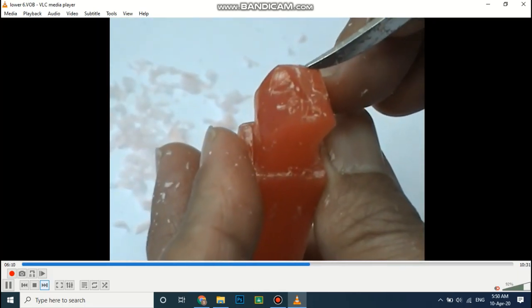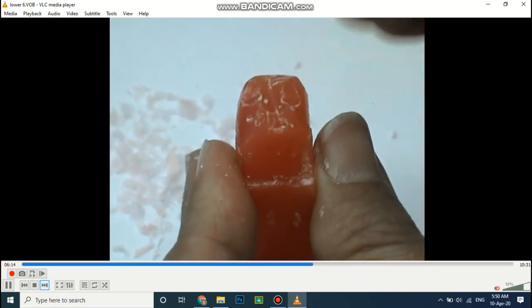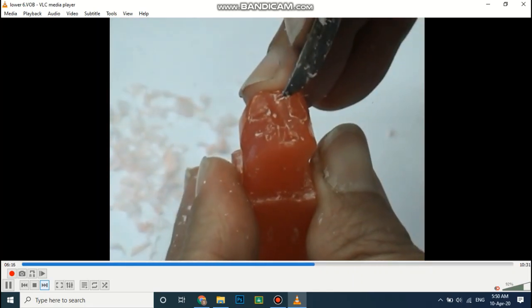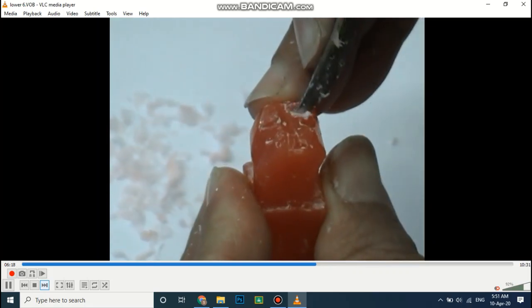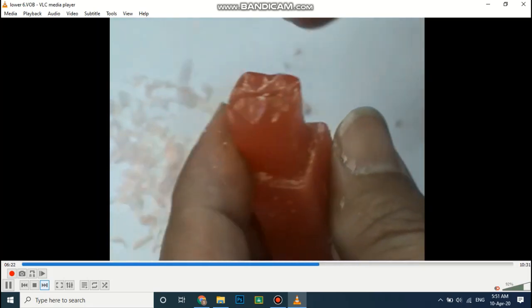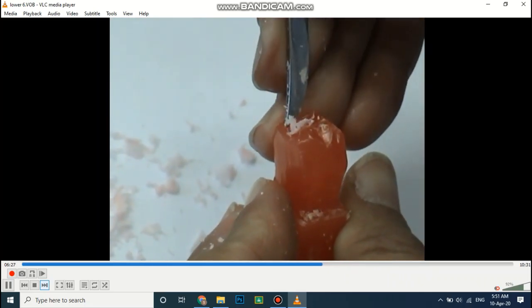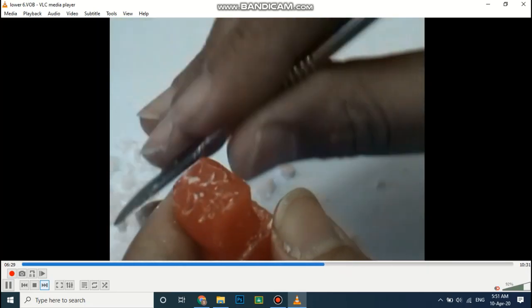Each cusp has a triangular ridge. Each triangular ridge should be looking forward, with gentle removal mesial and distal to the cusp, as we see here, to create the triangular ridge.